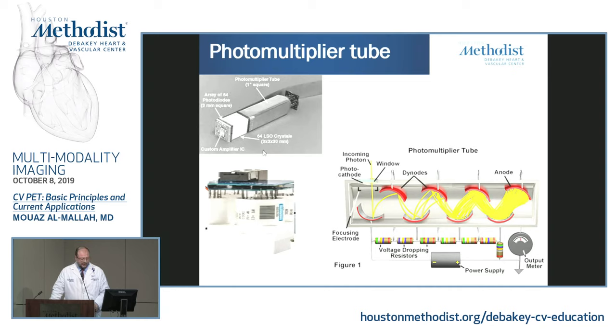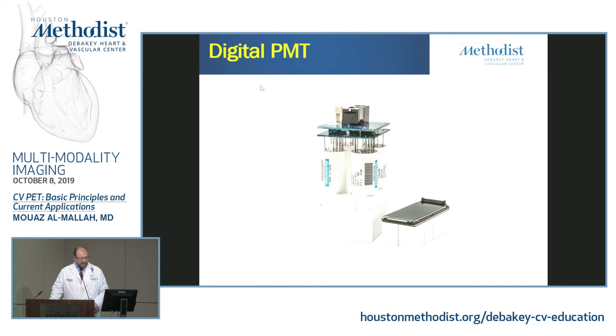So the detector, the LSO, is now just attached to electronics itself. So this is how it looks. This is the old PMT system, and now this is the newer one. So it's all chips in there, and now it's all electronics. And now it's electronically amplified, so technically you have higher capability of amplifying it. Now you have lower doses.